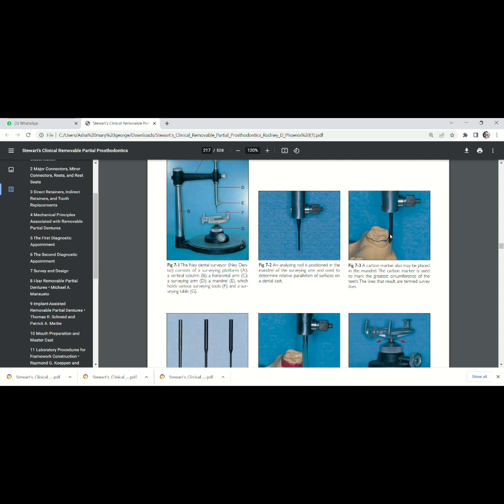So instead of this analyzing rod, if we pass the carbon marker over the tooth surface, we will get this drawing. This line is called the survey line. I will discuss the survey line later. Now we are discussing different types of surveying tools.